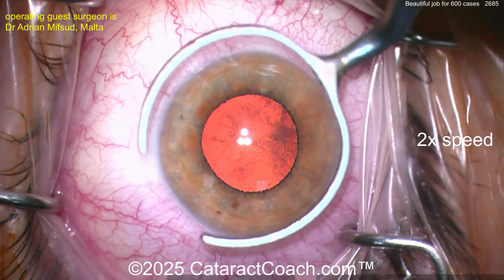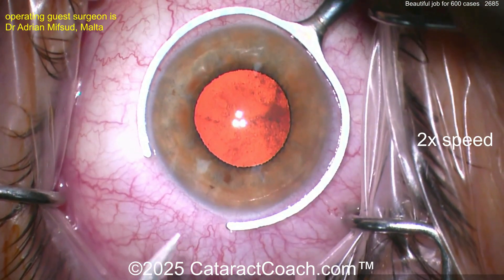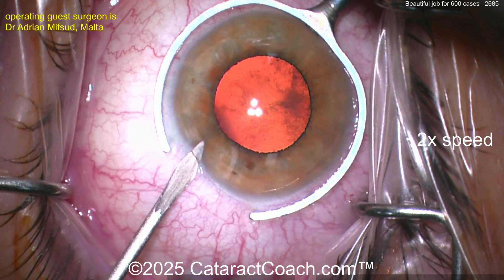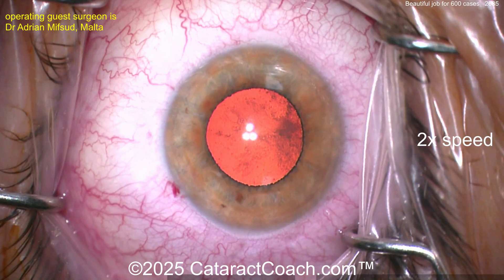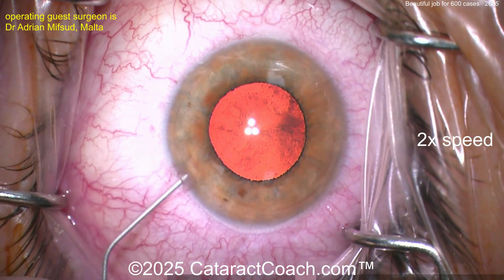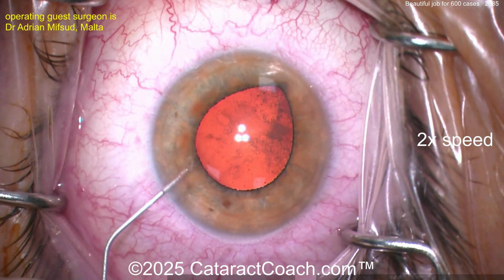We start the video at 2x normal speed so we can get through it. Here's a fixation ring and let's start off with a paracentesis. I like how you're nicking the limbal vessels. 600 cases is around that halfway mark of the learning curve. This one's actually a pretty good case.